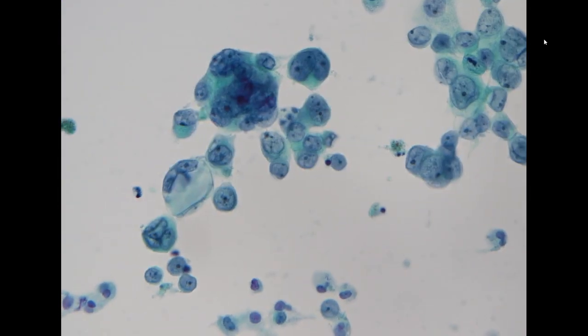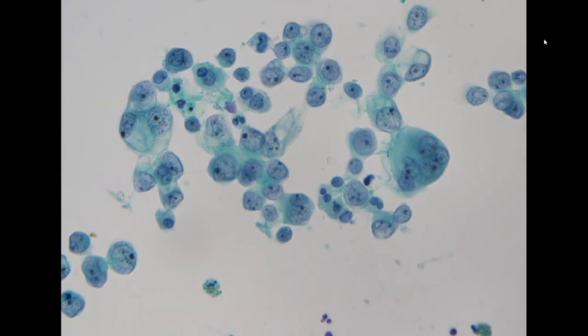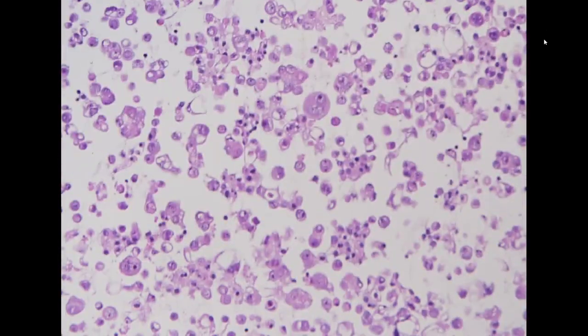You see a gigantic nucleus, prominent nucleolus, and vesicular chromatin, and you see glandular arrangements, some bubbles in the cytoplasm, and the tumor burden is really high, more than 80% of the cells that we see here are cancer cells. So this is very common for primary lung adenocarcinoma. This is a recurrent disease. This is her cell block, so they can use this cell block to do drug-resistance molecular testing.